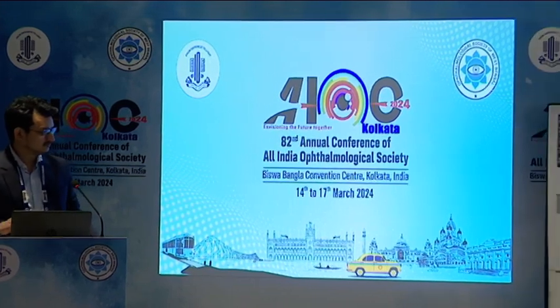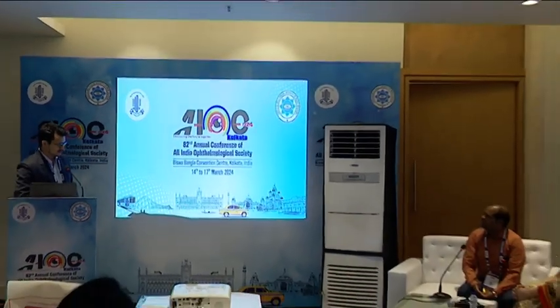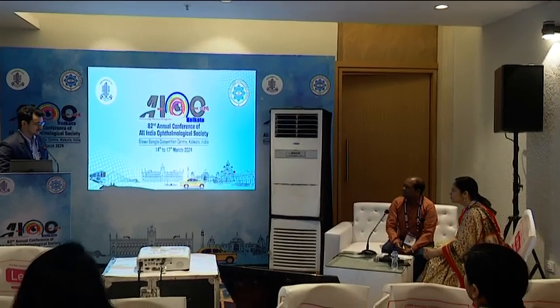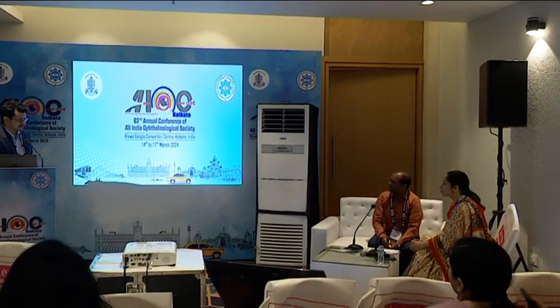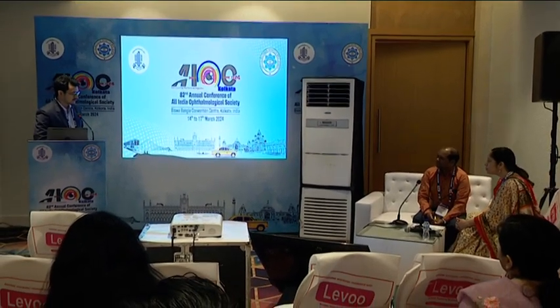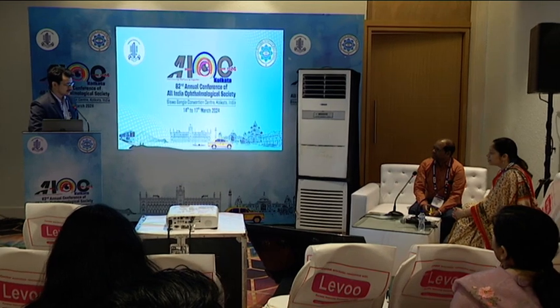What was the post-operative vision? Vision was 6/24, pre-operative was 3/60. So it was a case of post-traumatic? Post-traumatic. Traumatic, okay.